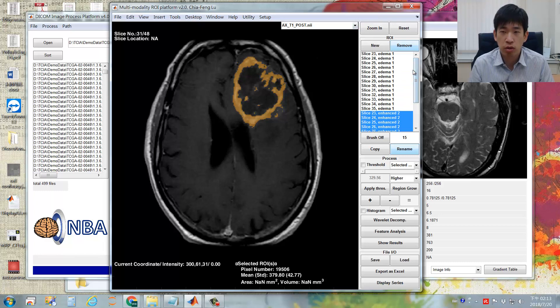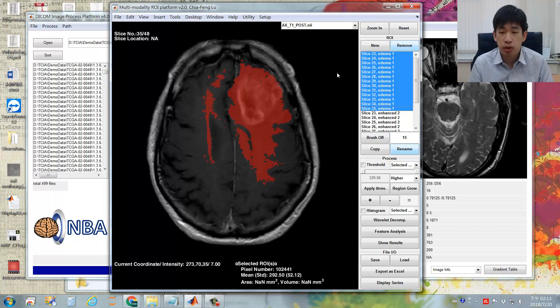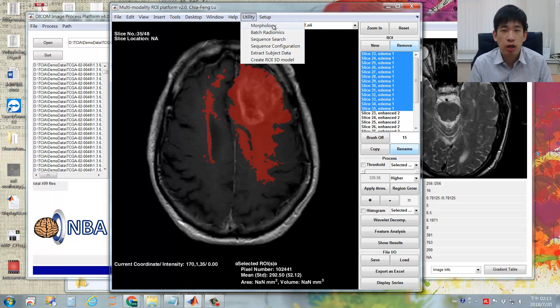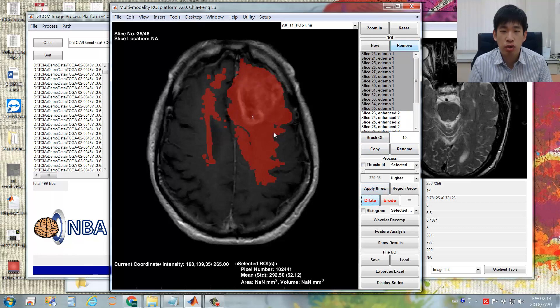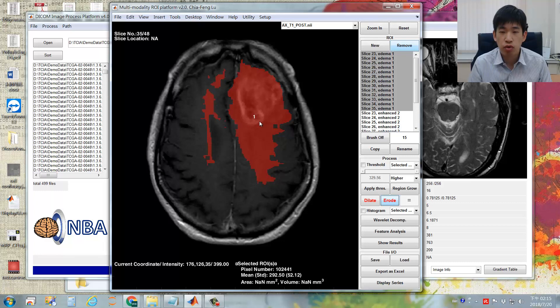In particular situations, you may want to perform morphological processing. Select the Morphology options under the Utility menu and click it — two new buttons will appear: Dilate and Erode. These perform mask dilation and mask erosion on selected ROIs. Clicking Dilate once will dilate the region by one pixel. You can also use the Erode button to remove pixels close to the margin. This is useful for accounting for partial volume effects.